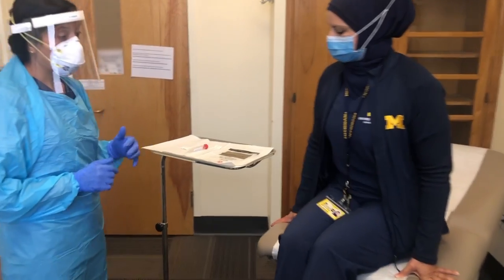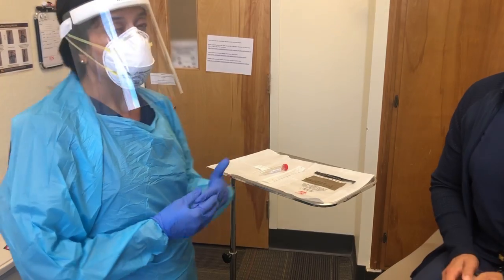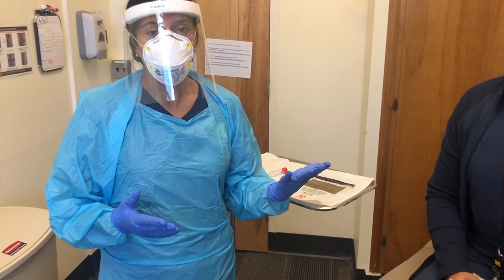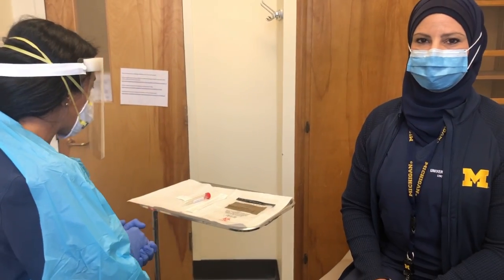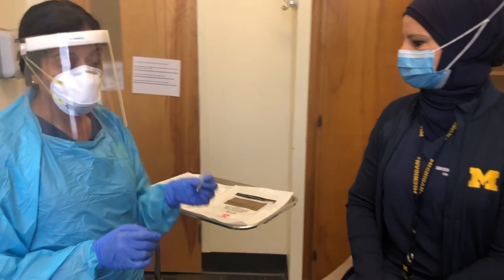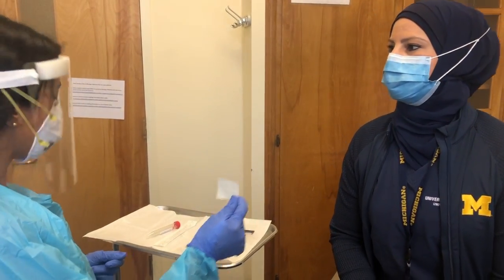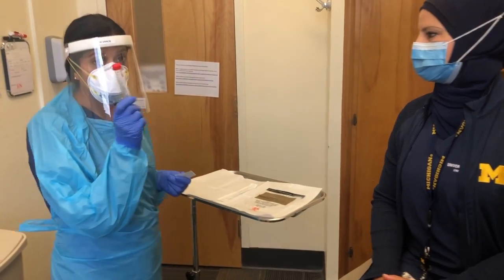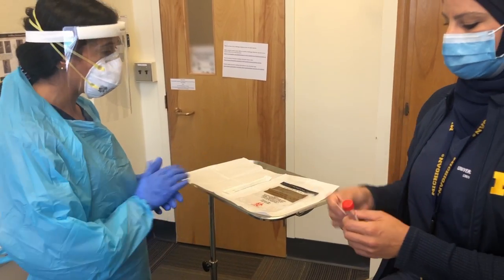So first, it's always a good idea to make sure that your patient has the appropriate mask on. If Layla had symptoms, we would want her to have a surgical ear loop mask on, which she has on. Then the next step would be confirming her name and date of birth on your label. Can you confirm that your name and date of birth are correct here? Yes, it's correct. Perfect. I'm going to hand her the tube and ask her to put her label on her tube herself.